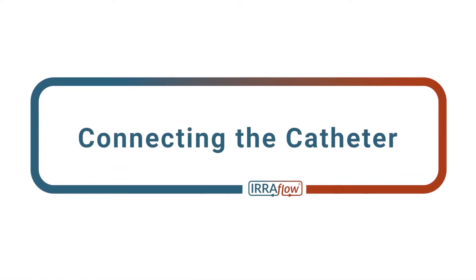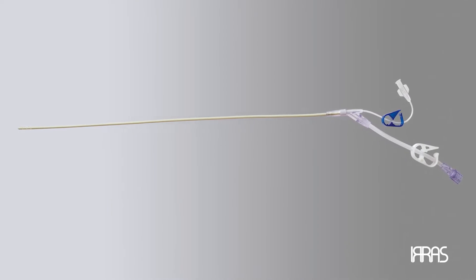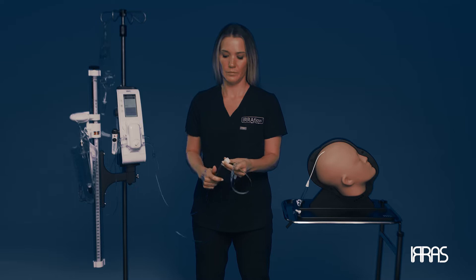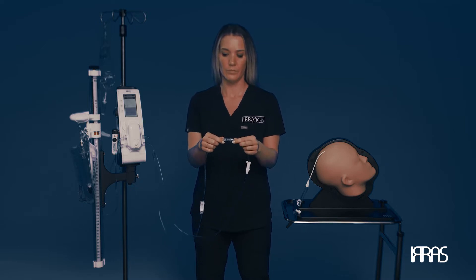Chapter 3: Connecting the Catheter. Once the IRRAflow catheter is unpacked and prepared in a sterile area and in a sterile manner, it is time to connect the IRRAflow dual-lumen catheter to the control unit.